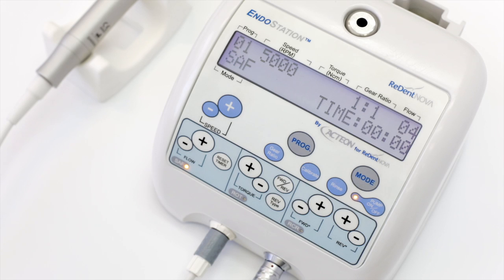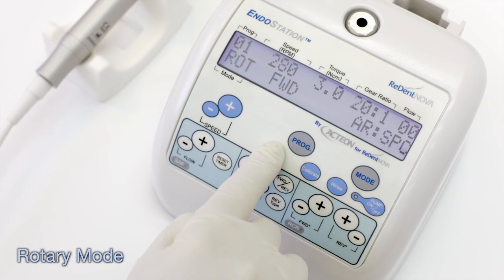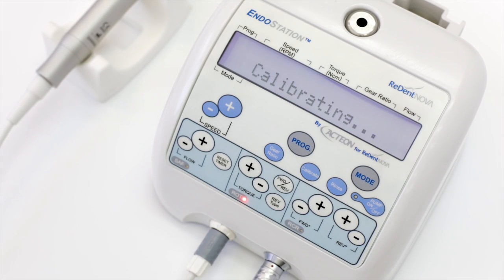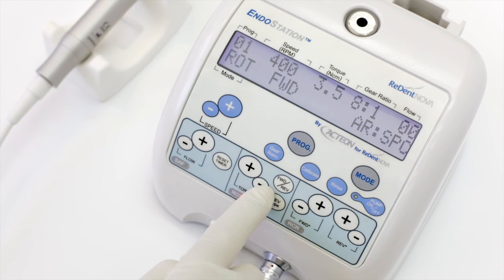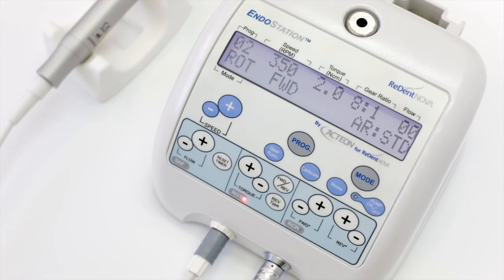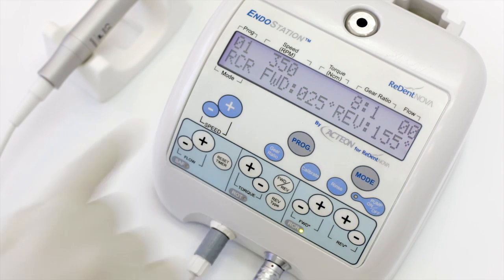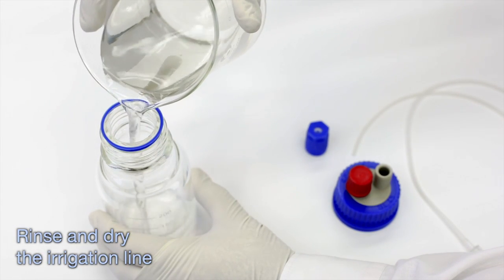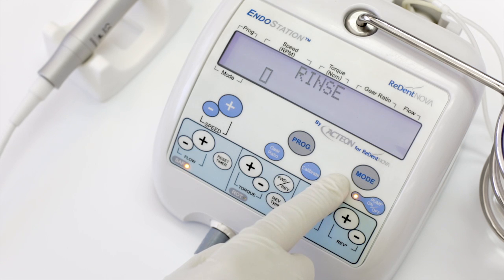When working in rotary and reciprocating modes, the irrigation system is disabled. For rotary mode, connect the suitable contra-angle handpiece, perform calibration, and adjust the speed and torque control levels according to the file system used. Rotation direction can be adjusted by the forward/reverse key, and the type of auto-reverse can be chosen using the reverse type key. For reciprocating mode, once the contra-angle has been connected and calibrated, adjust the speed and the rotation angles. To avoid clogging of the irrigation line, at the end of each workday, rinse the irrigation system by running clean water using the rinse key for at least 30 seconds, then dry by pumping air through the system.